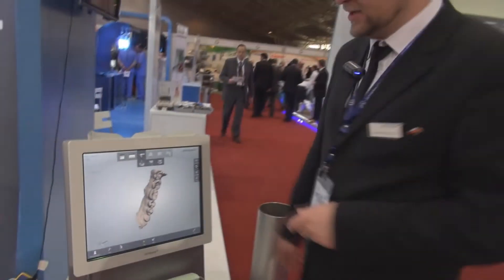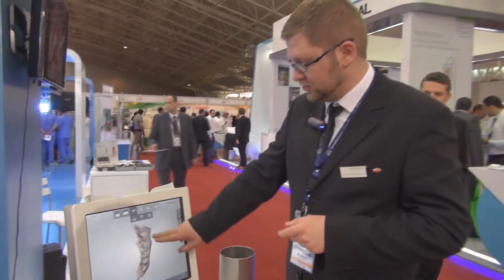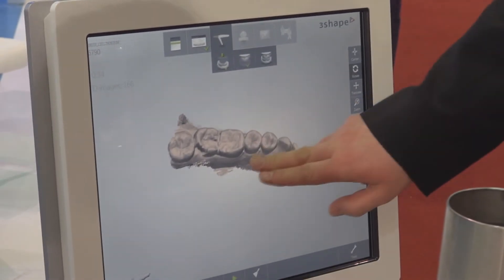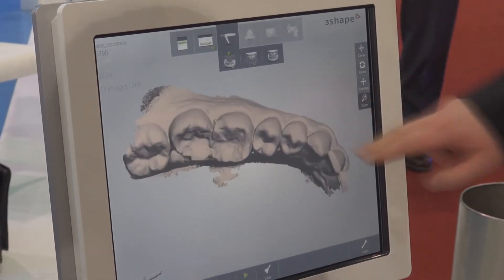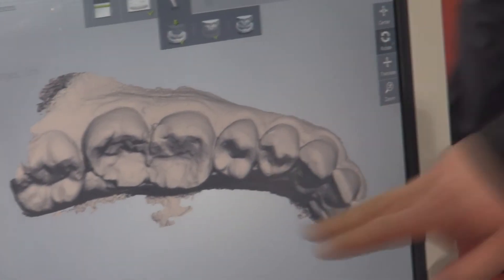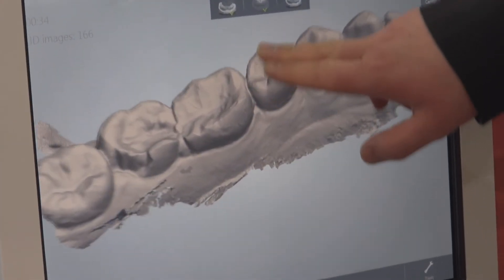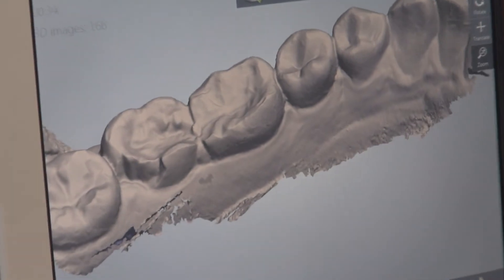As you can see, it's really easy and fast. It took me 34 seconds to scan a quadrant of a lower jaw. I was actually quite unfortunate last week — I had my tooth chipped, so you can see it quite clearly in here that there is a piece of a tooth missing.